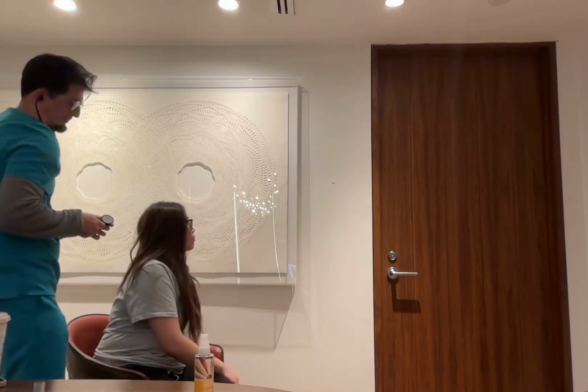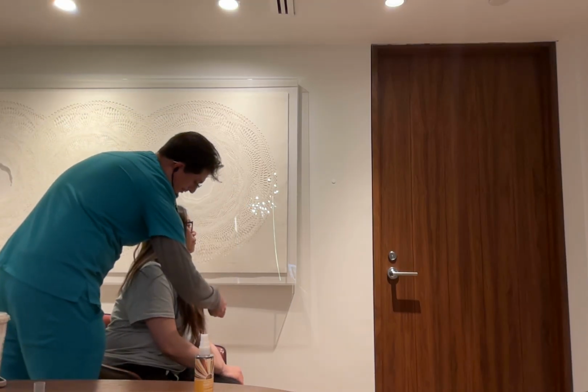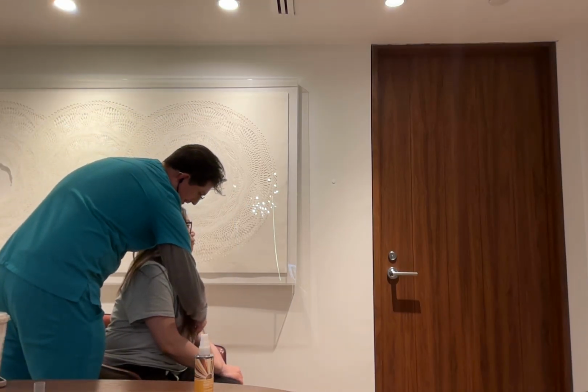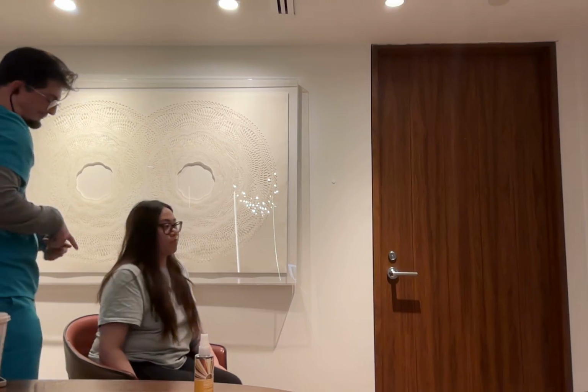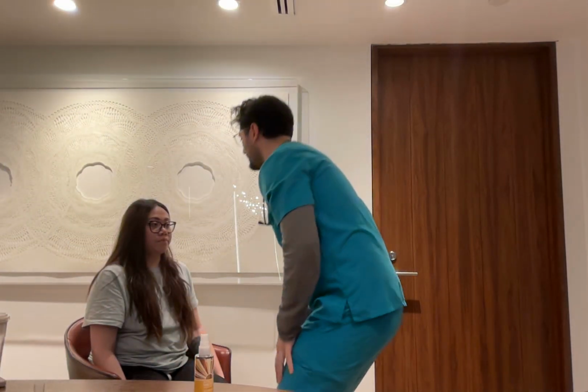And now I'm going to ask you to turn over to your left, and with the bell of my stethoscope, I'm going to listen for S3 at the fifth intercostal space at the left midclavicular line, and S3 is present. And now I'm going to come around and assess the carotids.